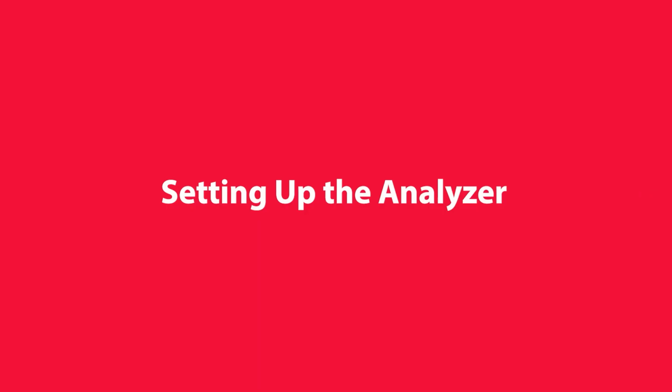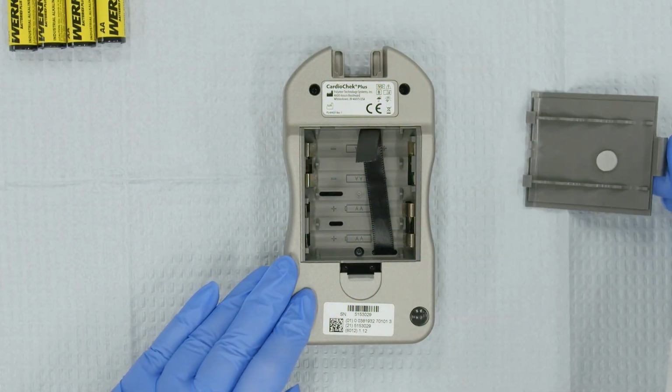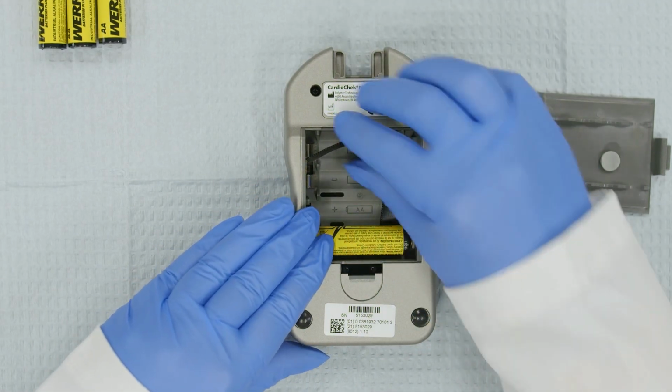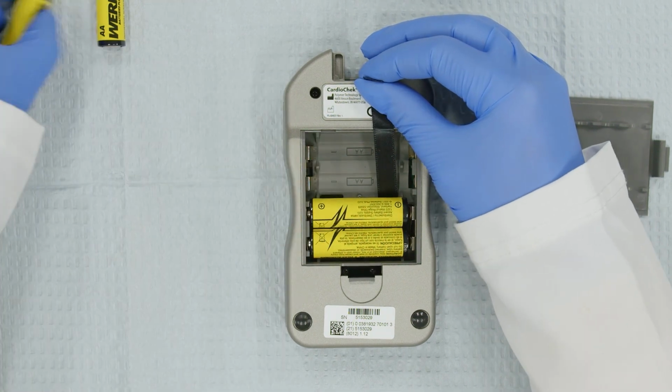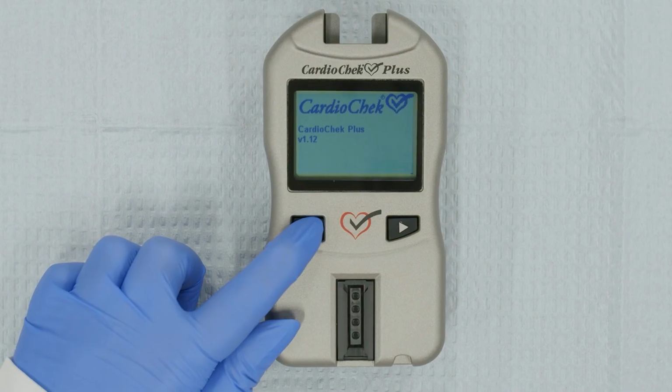The first time you use the analyzer, you'll need to install the batteries, and set the language, date, and time. First, install the batteries according to the instructions in the CardioChek Plus version 1.12 user guide. Take a moment to make sure the batteries are inserted correctly before moving on. Now that the batteries are installed, let's set the language.